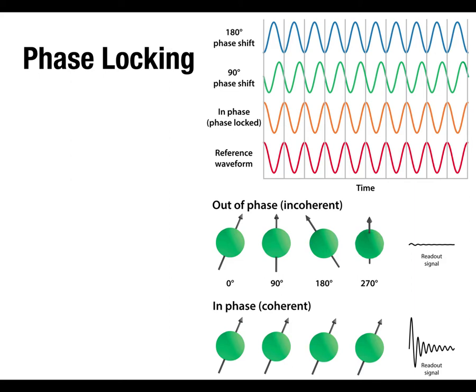And so that's where the phase locking comes in. The RF pulse is like the music, and the protons are the dancers. And so they're all lining up with the beat of the music and precessing with that, as long as that music is playing. Again, you're all standing up, you're dancing, because I'm playing the music, and then I stop the music. If you keep dancing, you're gradually going to fall out of sync with each other, especially if you aren't looking at each other, because there's nothing to align to.